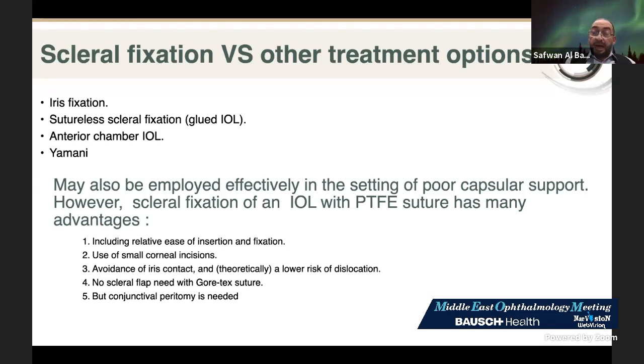No scleral flap is needed with the Goretex suture, but conjunctival peritomy is needed, in contrast to Yamani, where we don't need any conjunctival peritomy.